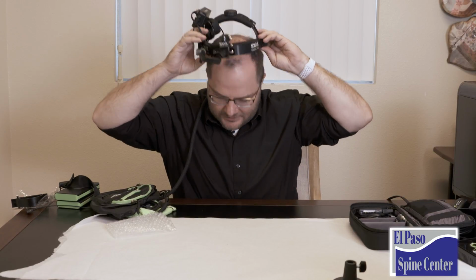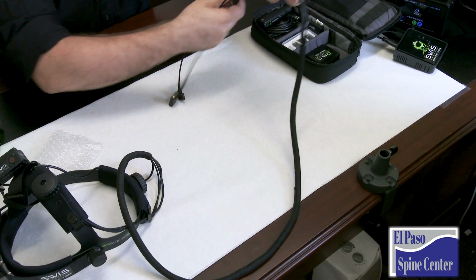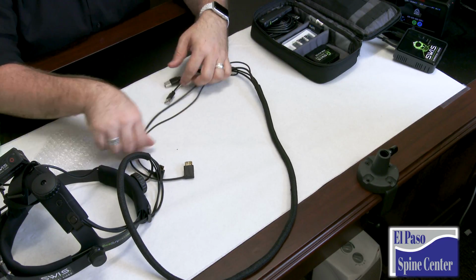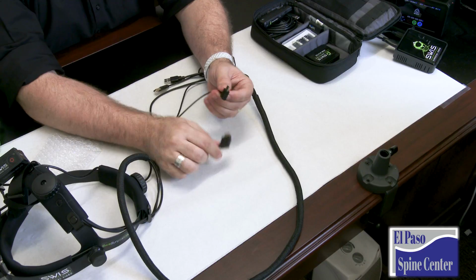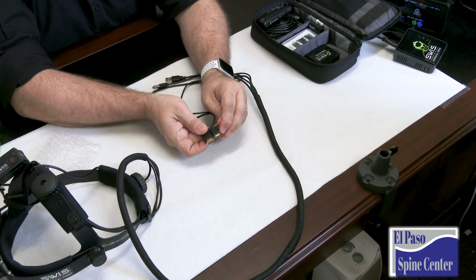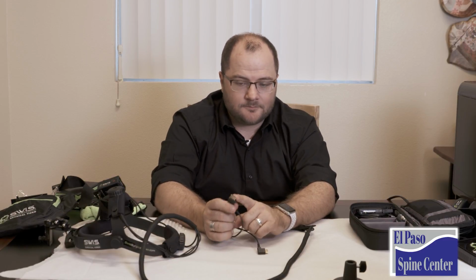Now, what about the other end of the cables? Well, this is where things start to get a little more interesting. At the other end of these cables, you have 4 different options right now. You have 2 USB, and you also have a full-size HDMI and a mini HDMI. There's not the micro HDMI. This is halfway between the full-size and the mini. The HDMI feed from the GoPro is going to the full-size HDMI.